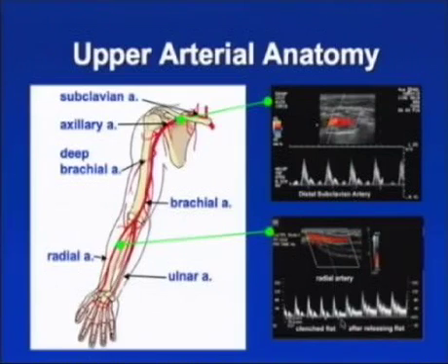This is a radial artery initially showing high resistance, but then after holding the fist tight for a few moments and releasing, we see this sort of increased inflow volume through this region, and that's pretty typical. Blood flow through the radial artery tends to be very variable depending on the vasoconstriction and dilatation of the digital arteries and the arterioles. So that's a quick review of the arterial anatomy.